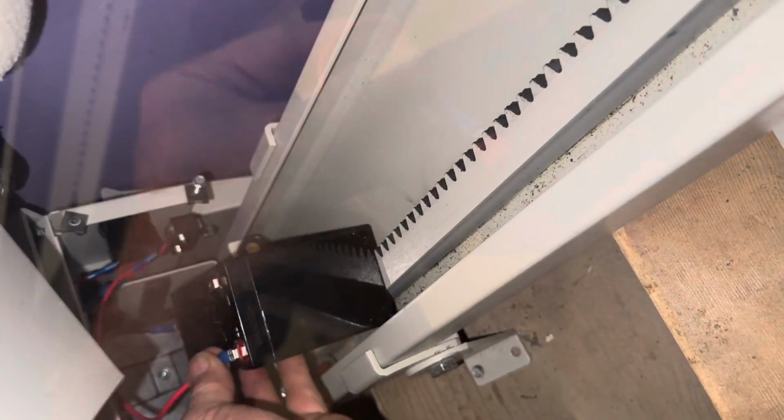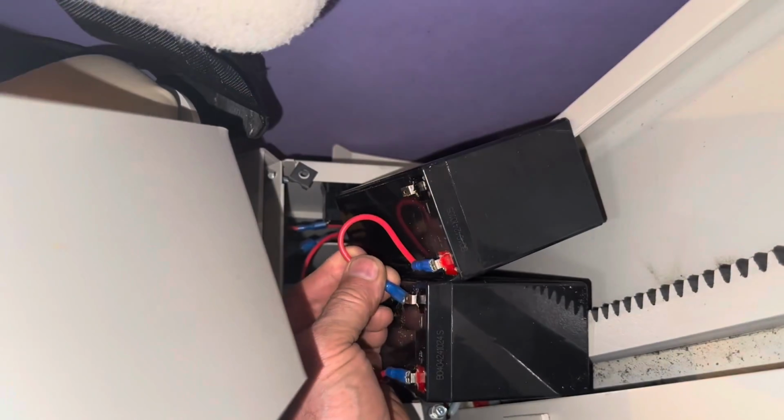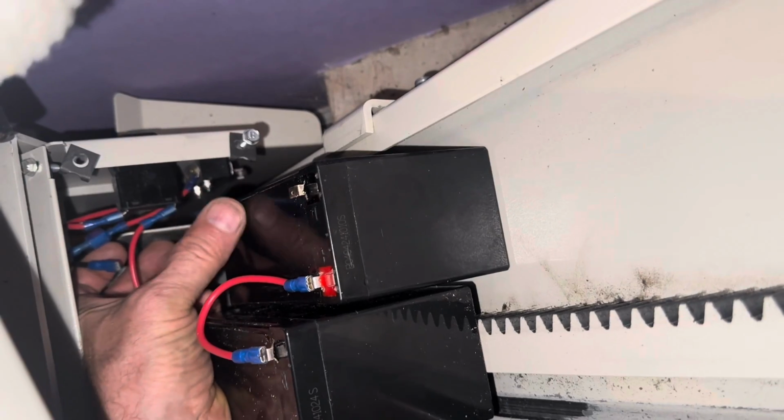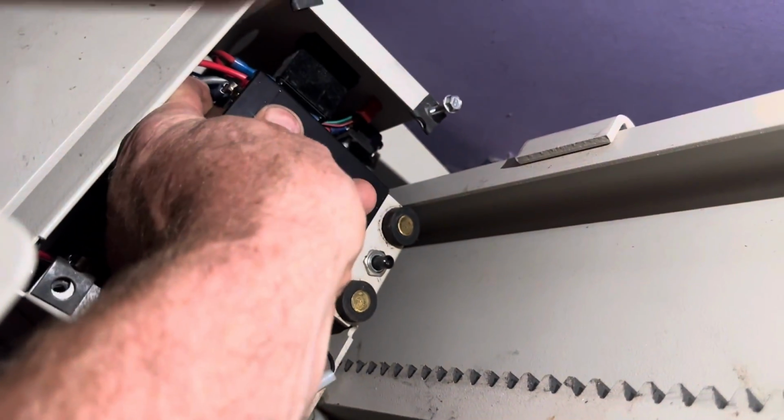Now we'll hook up the positive. Use the jumper wire to connect the positive to the negative on the other battery. Connect it in. The negative wire is all the way back here, so we have to push the batteries in and then connect the negative. Push the negative on. There's not a lot of wire in there.